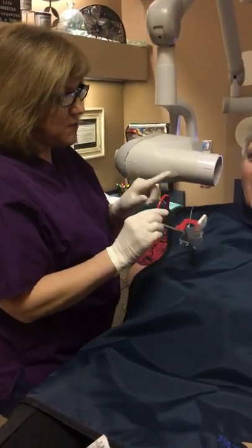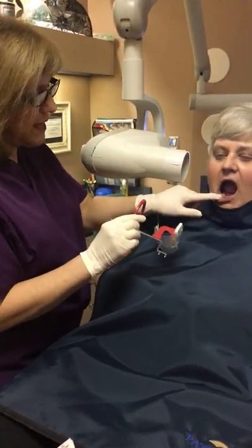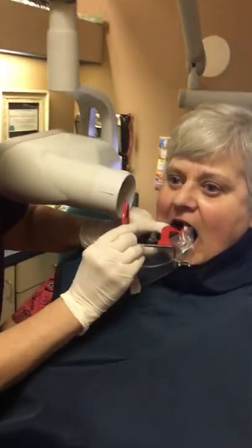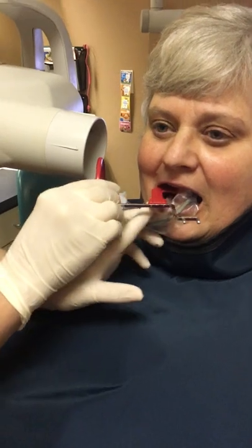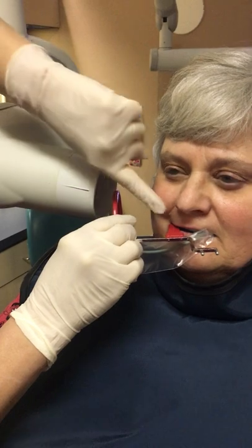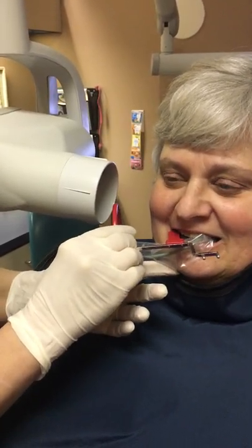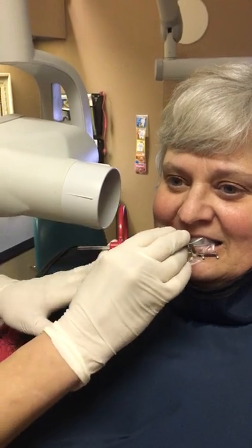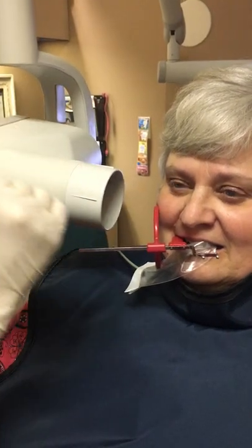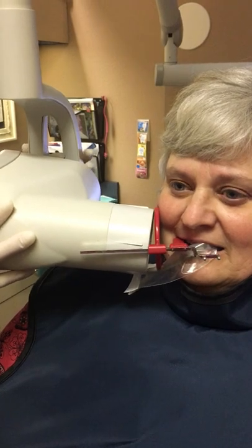Okay, this one we are taking the anterior — actually the bicuspid shot — coming all the way up to the anterior. We'll come in, and on this one I don't get them to bite down all the way; I leave it open a little bit. Start closing down, get her to smile a little bit so I can see the X-ray. Don't bite all the way — that way your palate won't push the X-ray back. If you keep them open just a tiny bit, you'll get all the way up to the anterior.